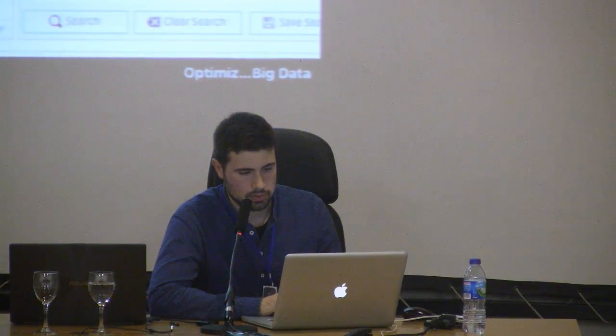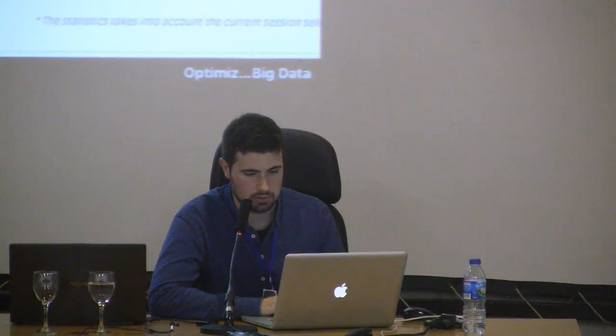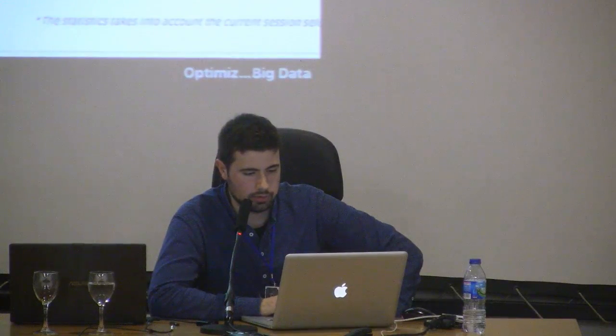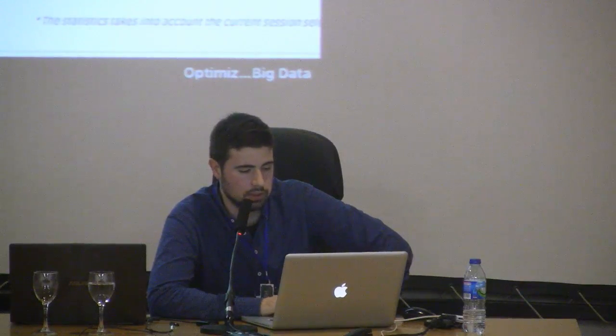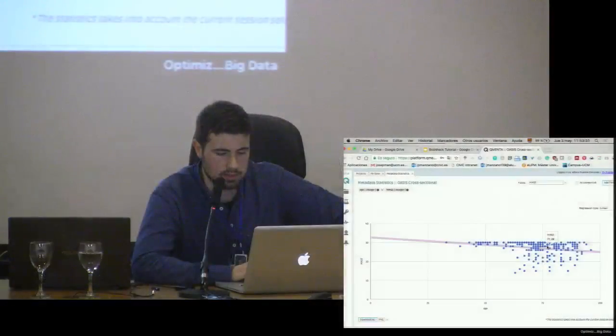You can also see metadata statistics, super easily. For instance, if you select one of the fields and it detects that this field is a number, be it float or integer, you will see automatically the distribution of ages for this study. And then you can pick one of the indices for this study, and it will automatically compute the regression for this data, although obviously in this case it's not very representative of the information that I selected.